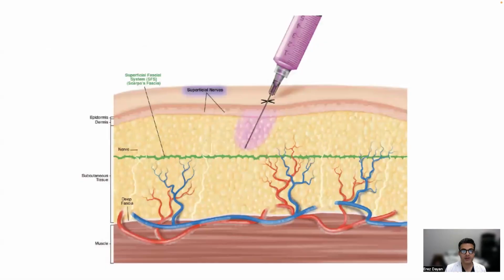So I want to show you how we perform local anesthesia step by step, so you can really understand what the best practices are to numb the patient with minimal pain. And I think the local anesthesia portion of this is really critical, because if the patient starts to feel discomfort, it will make them tense and it will make them more sensitive to discomfort later in the procedure. So really getting this right is key.